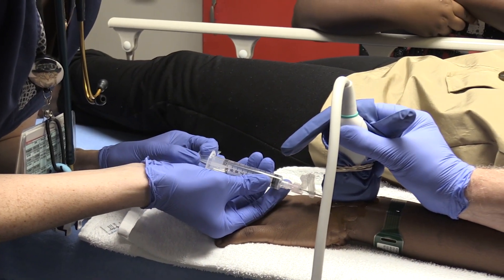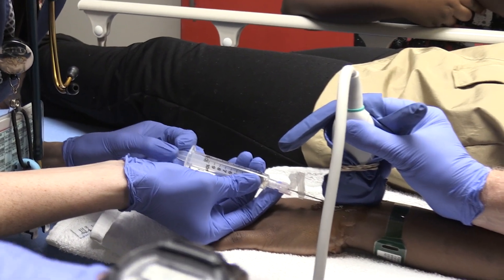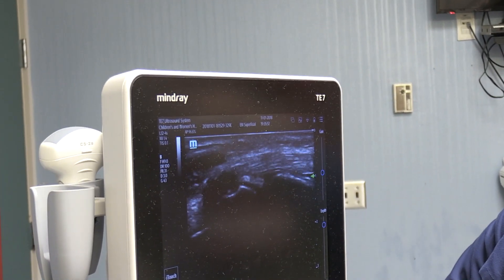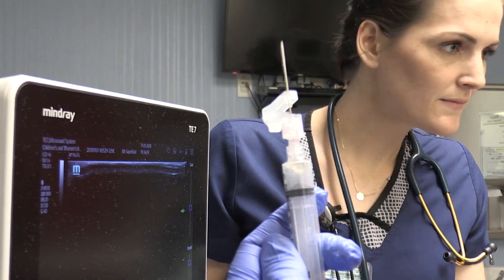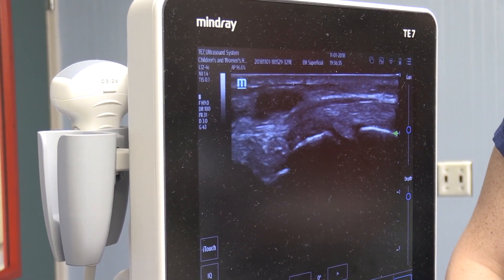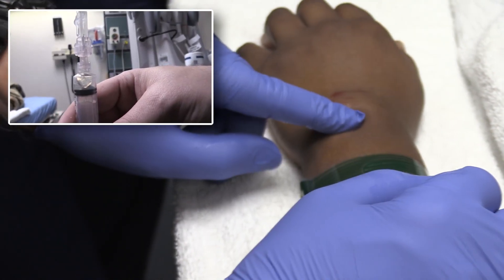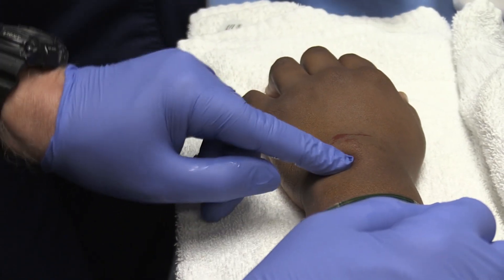There's stuff coming out — I see it, I'm watching it getting smaller. It seals out, but we did collapse it some. Very gelatinous — see that stuff? It's much flatter than what it was. Still a little gelatinous stuff in there, but you got as much as you could. It wasn't coming anymore. We dramatically reduced this — it's 75 percent smaller, almost 100 percent. I don't feel that bulging anymore, so it worked.